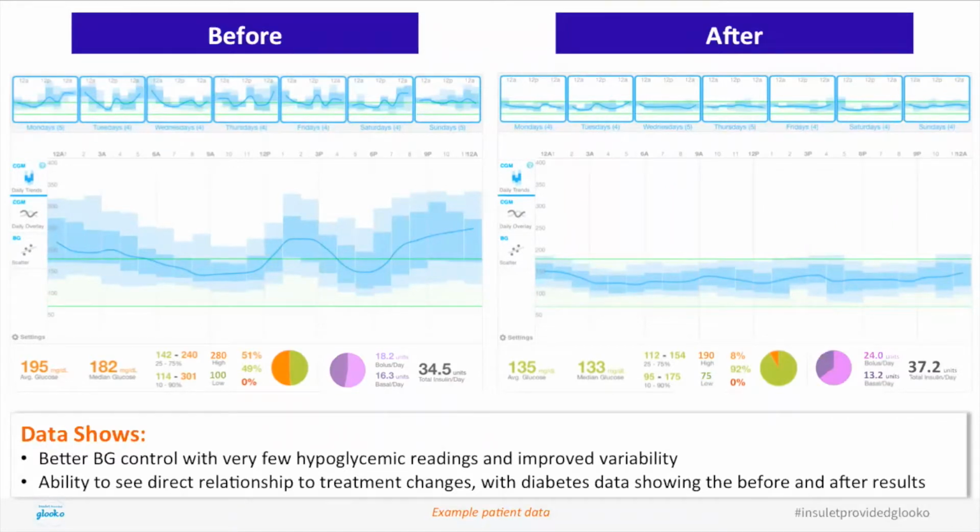Here are Allison's before and after glucose levels based on the advice and collaboration with her healthcare team. She feels more comfortable correcting now, whereas before she wasn't correcting due to her fear of lows or of using devices and medications in public. Given the ability for Allison and her healthcare professional to view the data easily, Allison's basal and bolus doses can be adjusted as necessary pre and post-conception.